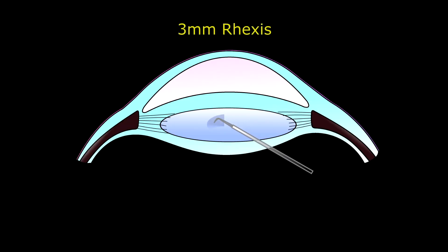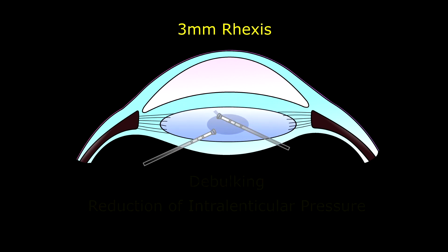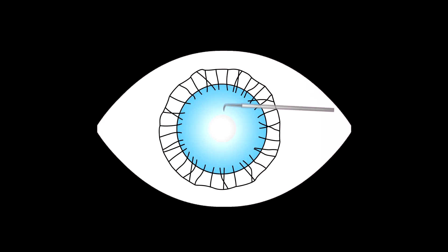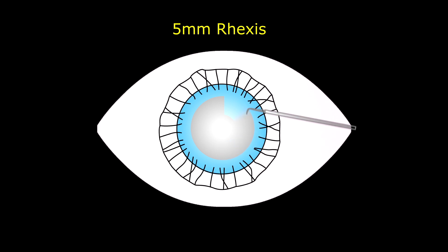This already described technique suggests an initial 3mm rhexis, reducing centrifugal force, followed by debulking and reduction of intralenticular pressure. Following this, a successful 5mm extension can be done under cohesive viscoelastics.